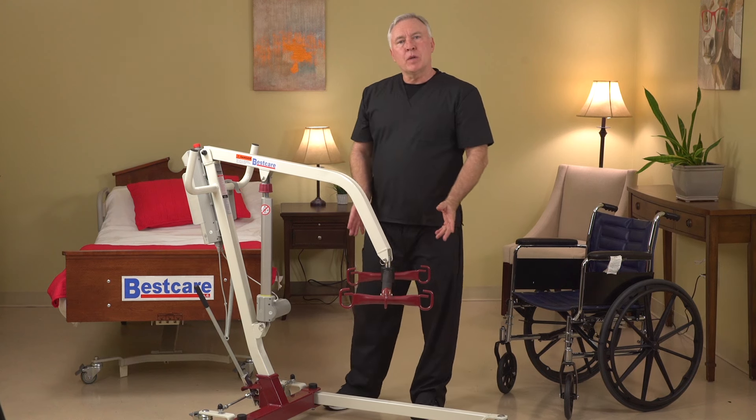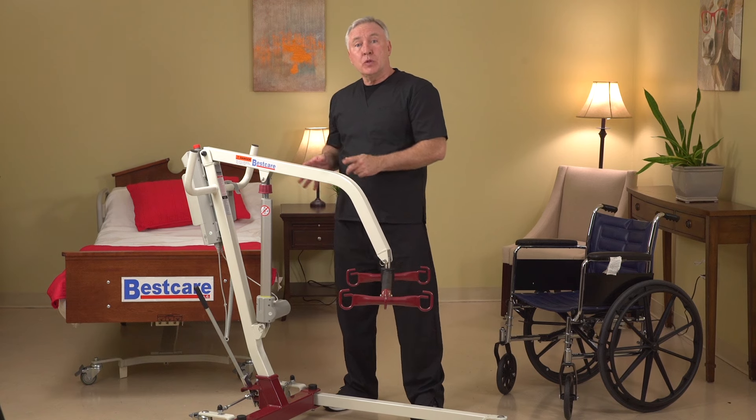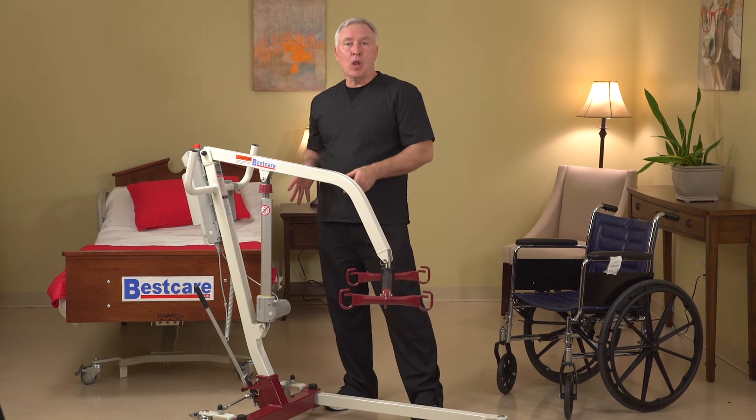Hey folks, Damian here with Best Care. I'm here to show you our brand new PL182-228 patient lift in our careter line.